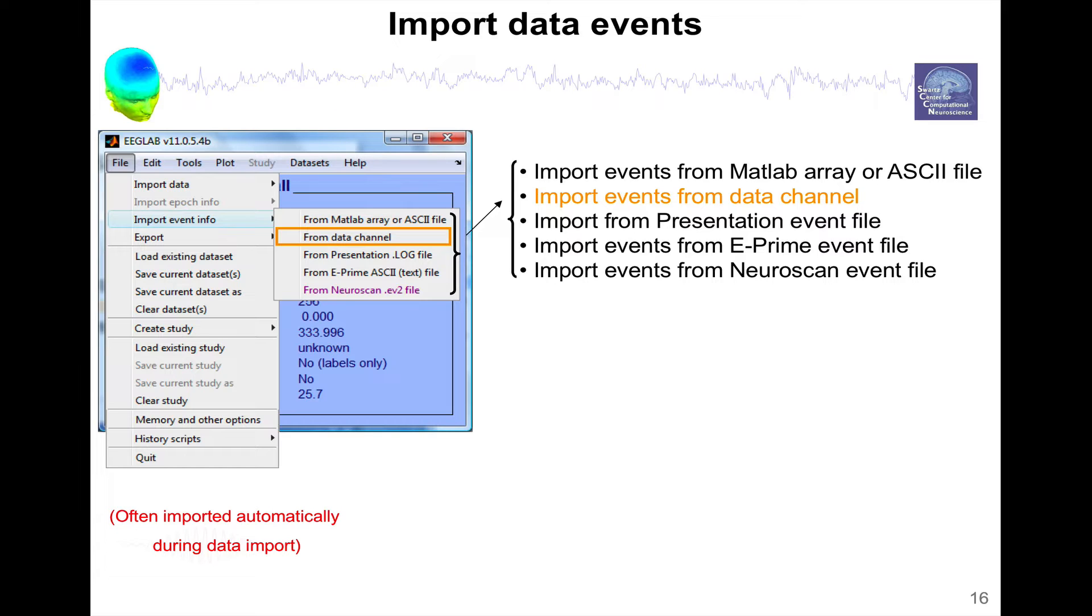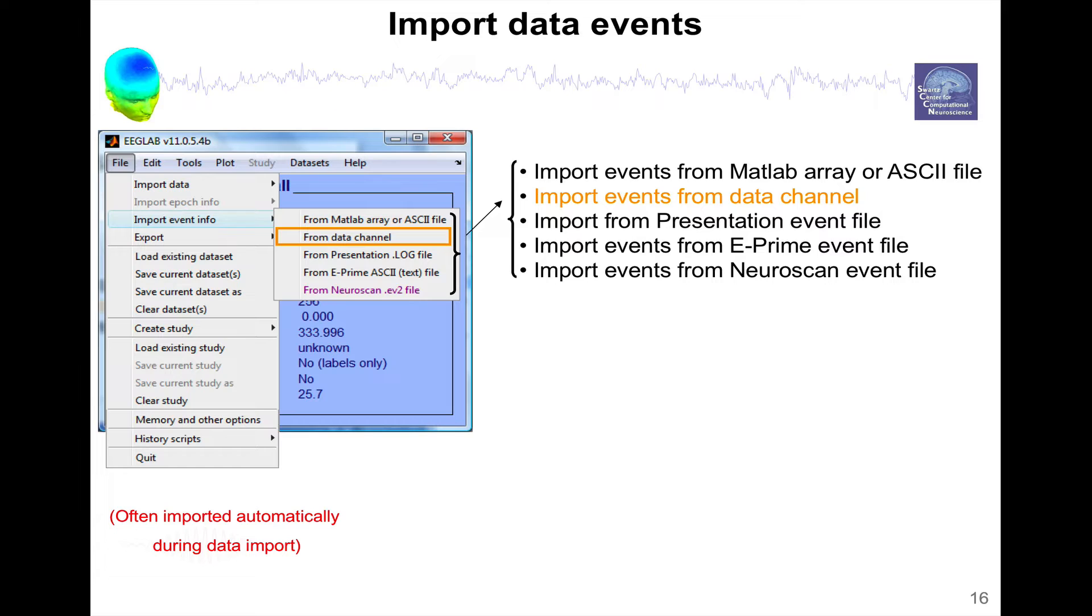When it's from another software, your EEG amplifier only has limited information. It just has a number for the event and then you want to associate more information. Sometimes you might just have the stimulus saved along with the EEG file, but reaction times are not saved, so you want to put back the reaction time along with the EEG data.